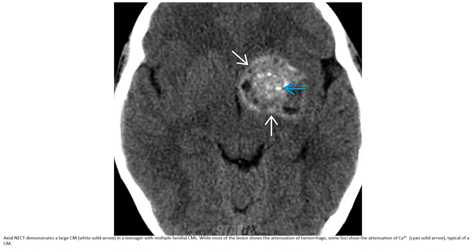Non-contrast CT demonstrates a large cavernous malformation in a teenager with multiple familial cavernous malformations. While most of the lesions show attenuation of hemorrhage, some show mixed attenuation typical of cavernous malformation.